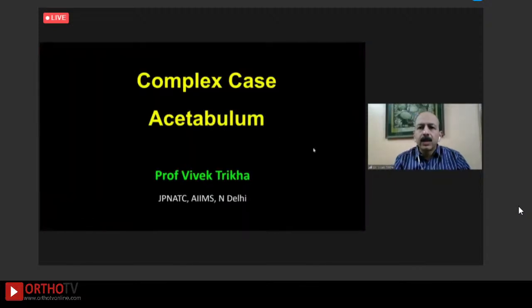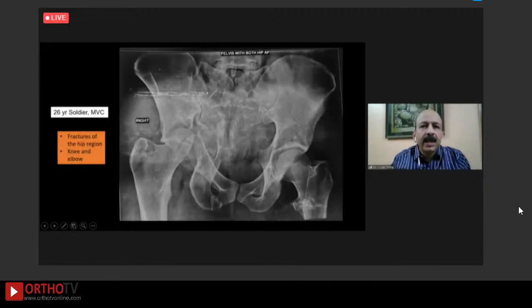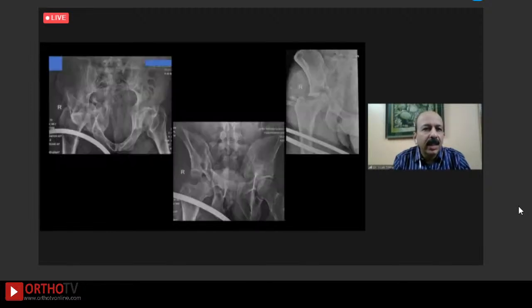Okay. So now we go to a complex case in acetabular fracture. He was a 26-year-old soldier who had a motor vehicle accident when he had come to his hometown. And he had this sort of an X-ray with which he came to us, with a fracture of the acetabular region. He also had some injuries to his knee and one of his elbows. So it looks like a complex fracture of an acetabulum involving both the columns, which we can see.